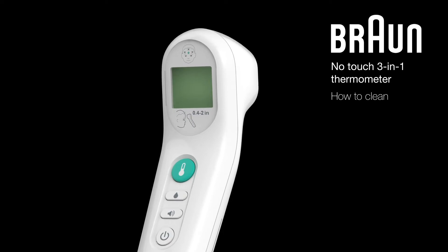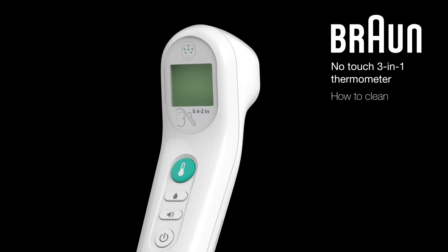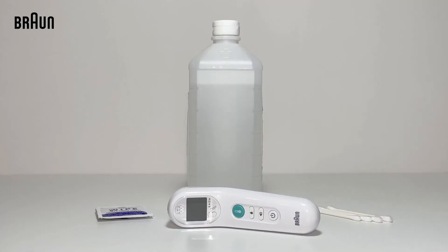The Braun No-Touch 3-in-1 Thermometer should be cleaned between uses using these simple steps. To get started, you will need an alcohol swipe or cotton swab moistened with alcohol.